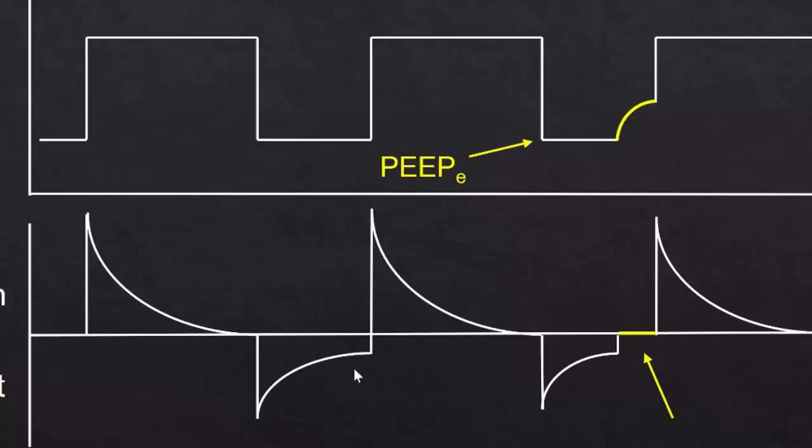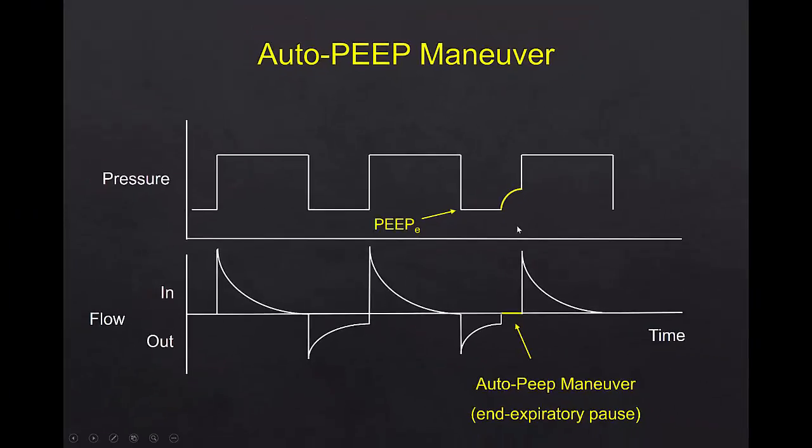We could tell it's there because of the presence of expiratory flow at end expiration, but we didn't know how much there was until we measured this. So I wanted to remind, if you didn't see my first talk, that when there's no flow, the pressure is equilibrated. The pressure is the same level at both ends of the no flow. We just talked about that. This extra intrinsic PEEP adds to PEEP to cause the total PEEP.